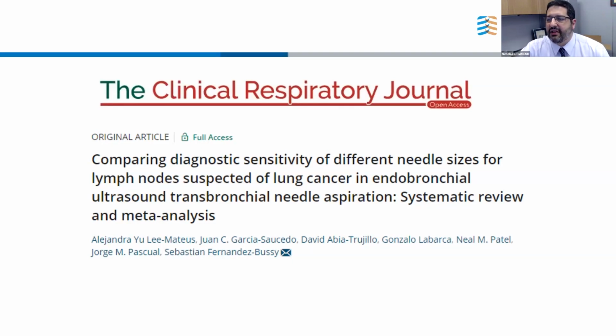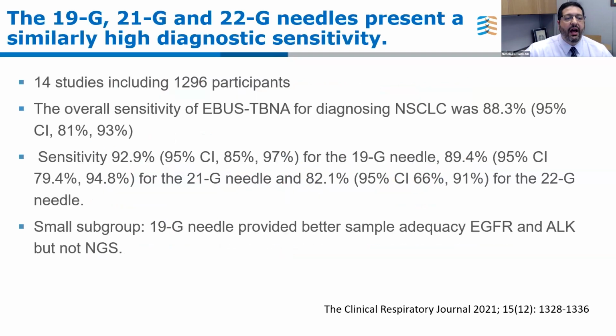This is kind of a controversial topic. The reality is that no one can say one needle size produces a higher yield than another. That has not been reproduced in randomized control trials and comparative effectiveness trials. This is a systematic review and meta-analysis, and it looked at 14 studies, very heterogeneous studies.